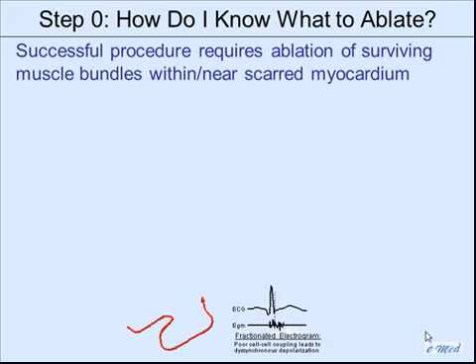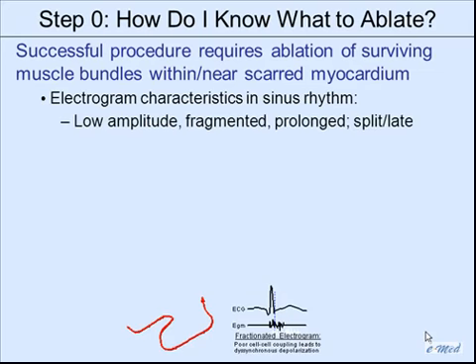It turned out not to be a problem. Now, how do you know what to ablate? Forget this for a second here. We need to look at the sites that have these surviving bundles of muscle.